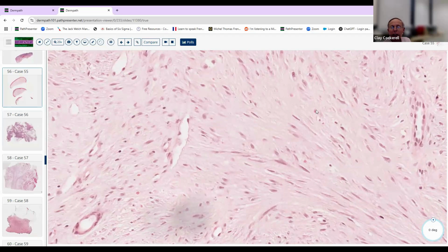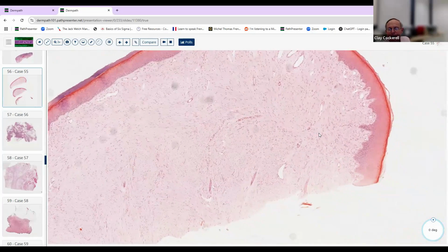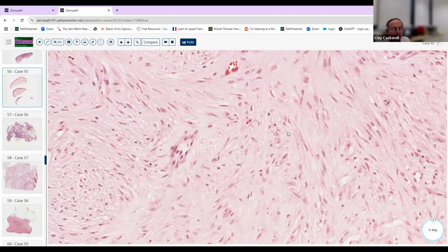And they'll show you a picture of this. It's a dome-shaped lesion on the digit of a child, and then they'll show you this pathology. This is what it's supposed to look like. So make sure you can recognize those little apical pink dots at the tip of these things. That's very classic for this lesion.